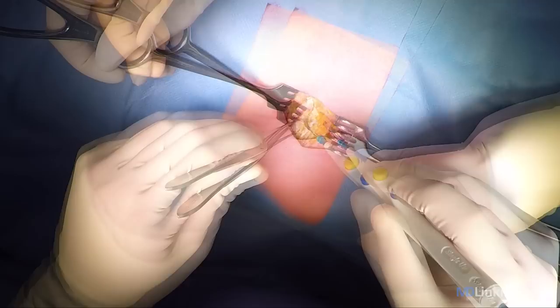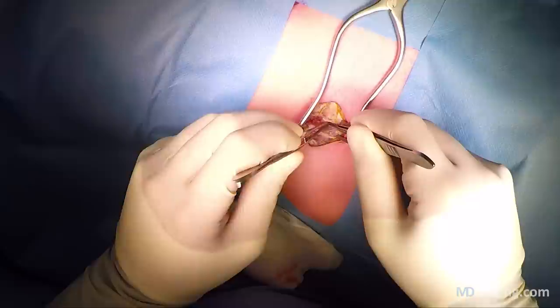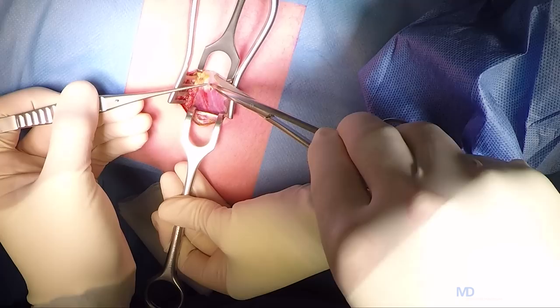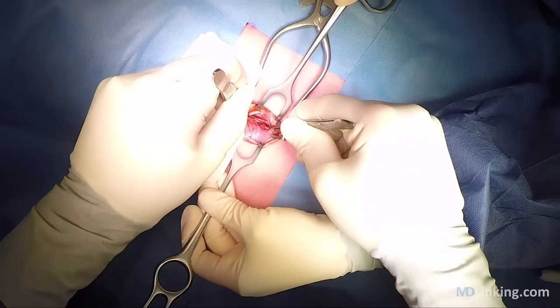Then we come across the aponeurosis of the external oblique muscle, which we open up also. We then proceed with the atraumatic spreading of the muscle fibers. Once we've done that, you'll see the posterior aponeurosis, which is not always present at that point — depending on how far the arcuate line of the rectus sheath extends.